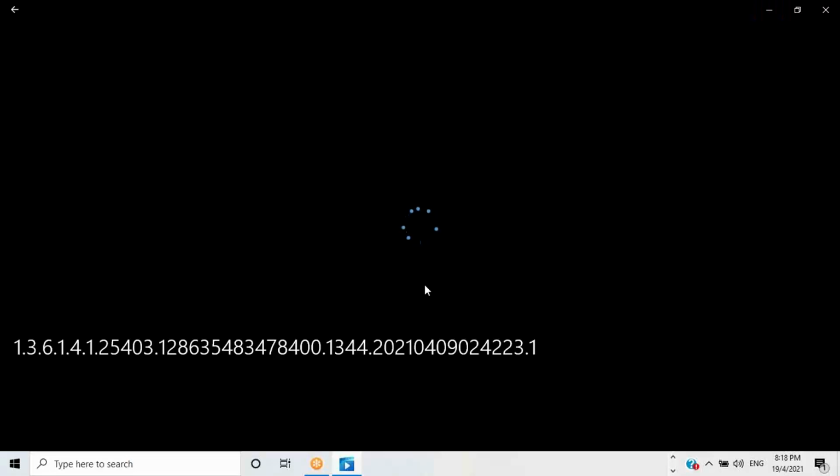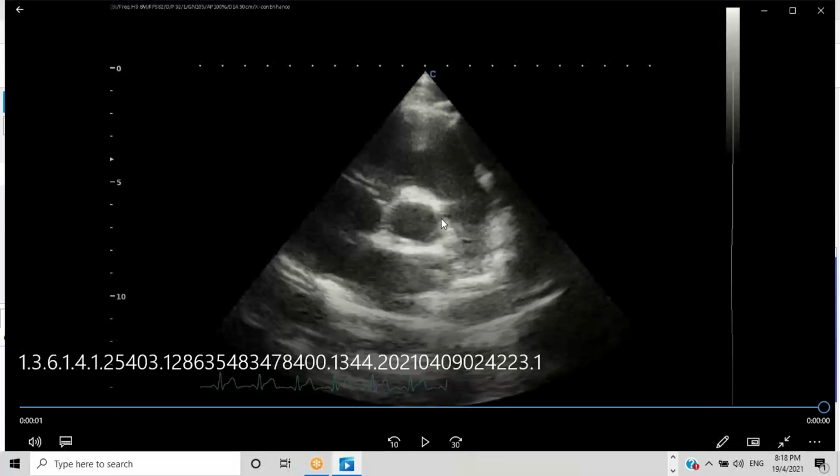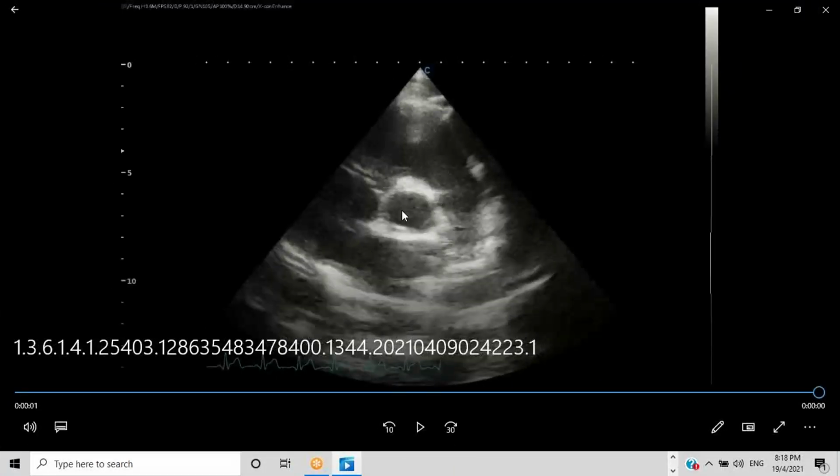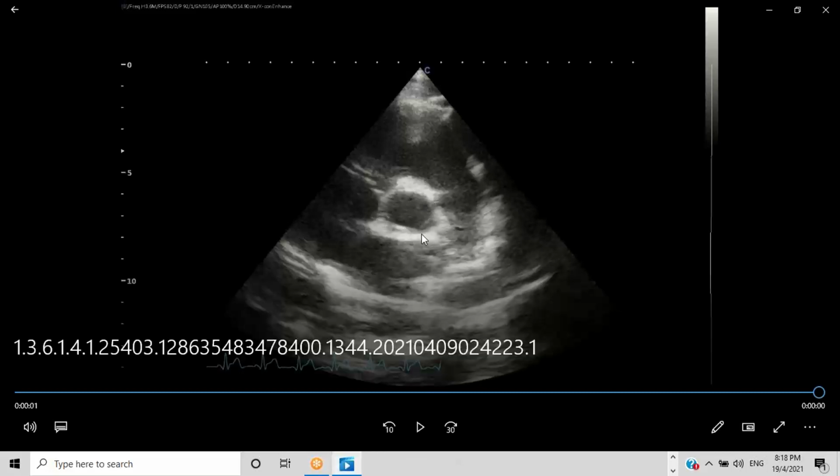But as you can see, when we do our studies, the studies are loaded with Doppler. So again, the short axis at the level of the aorta. You're going to rotate your transducer from the area that you got your parasternal long axis. You're going to do a clockwise rotation, 1 or 2 o'clock position. You're going to pull the angle of the transducer downwards, and you're going to get the aorta with the aortic valve in place. Pulmonic valve is right there, pulmonary trunk, and it's going to split to give you a right and a left. And then this is the RV.